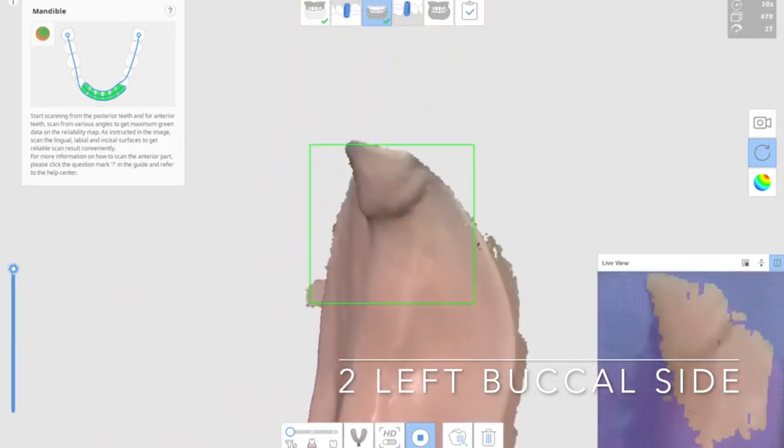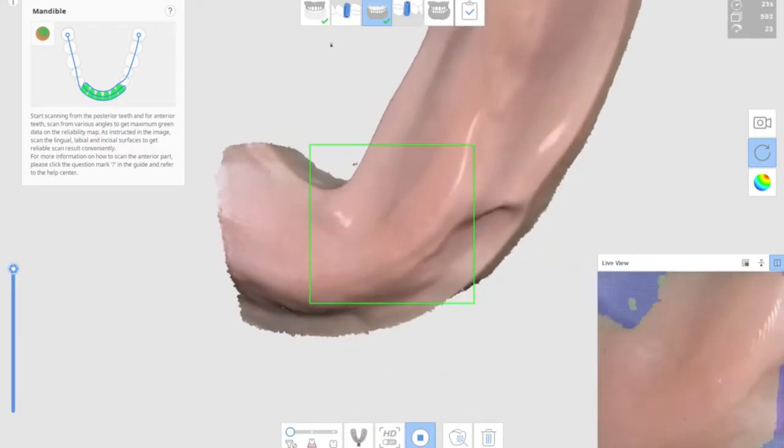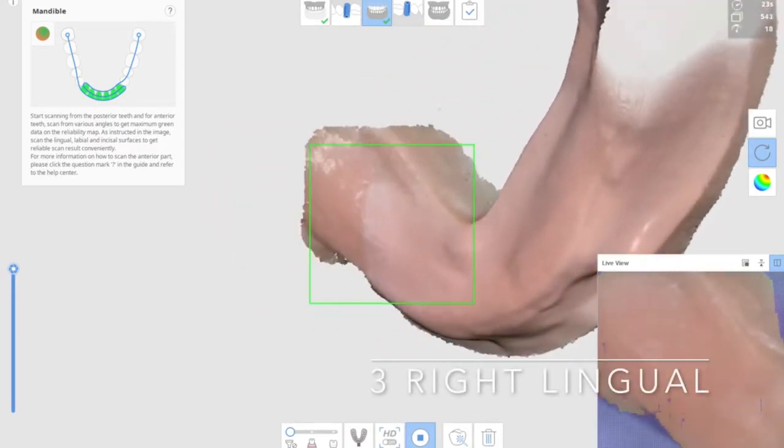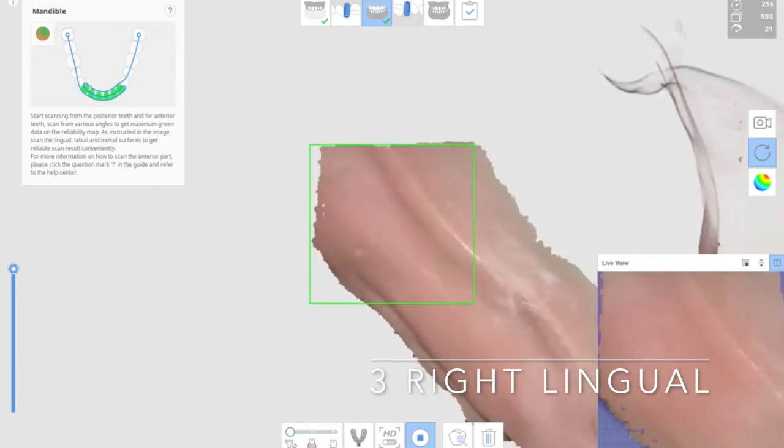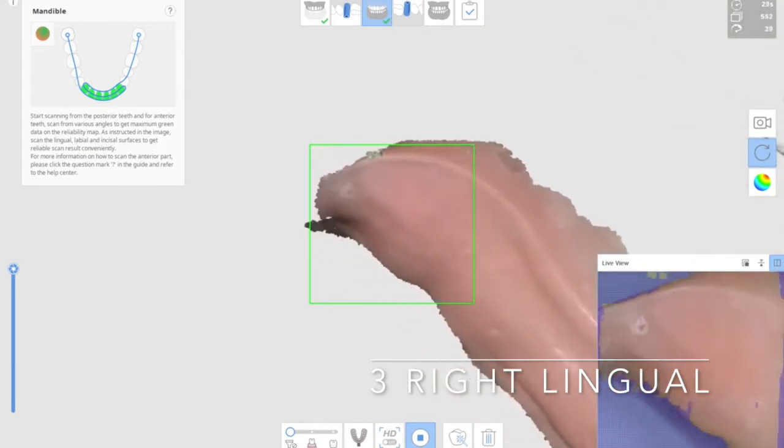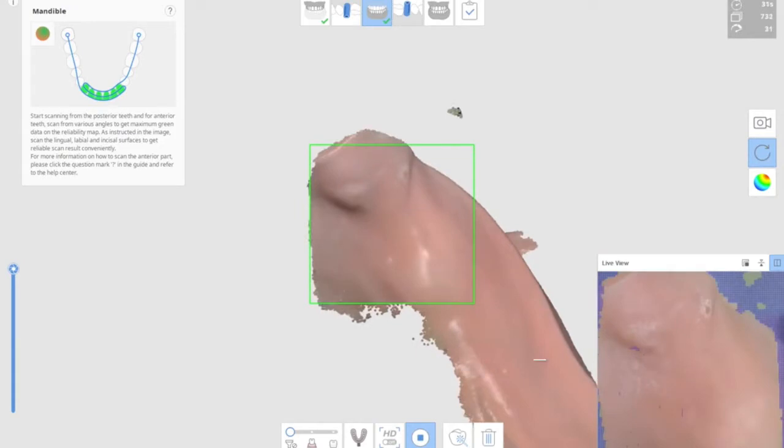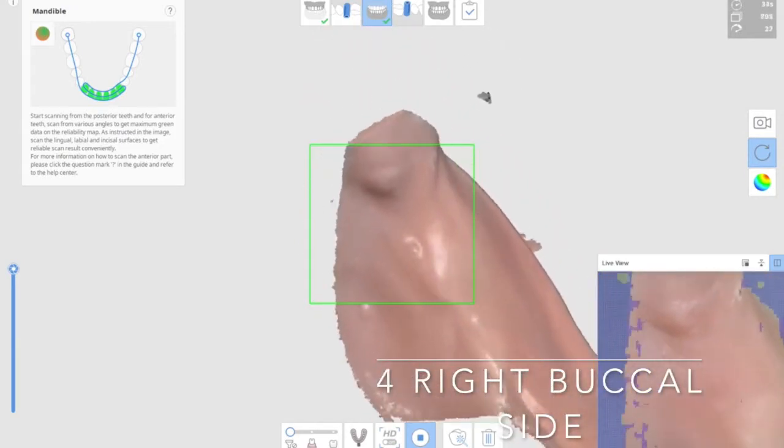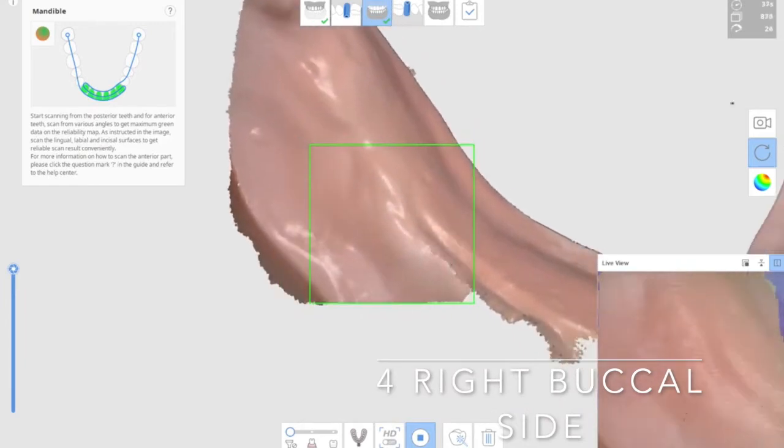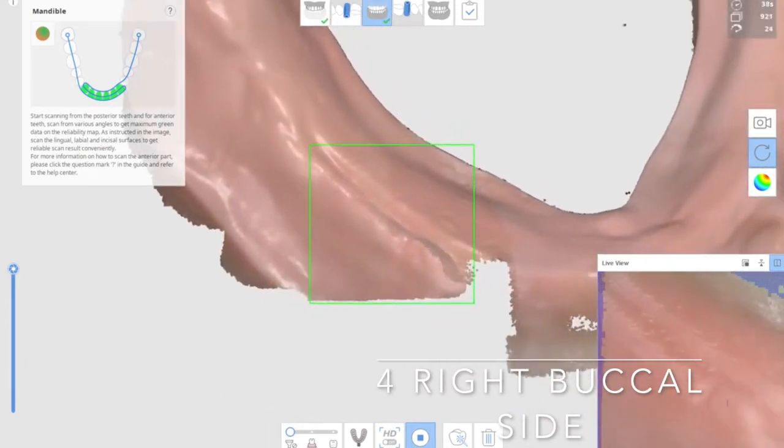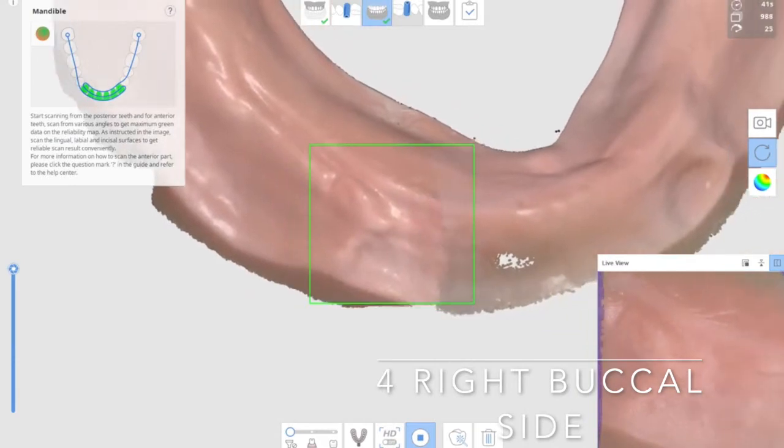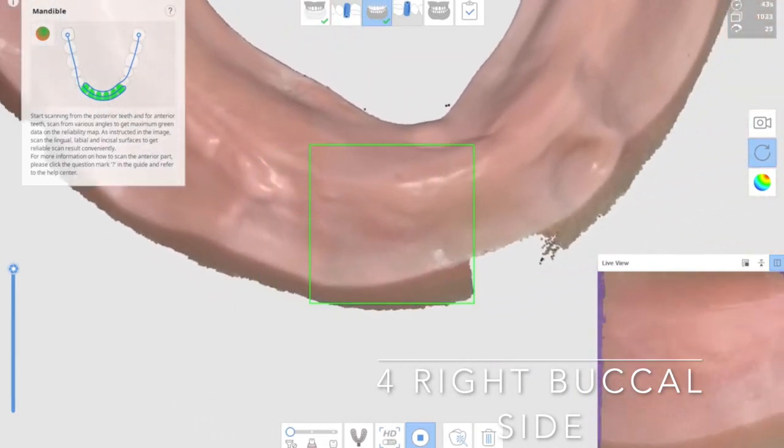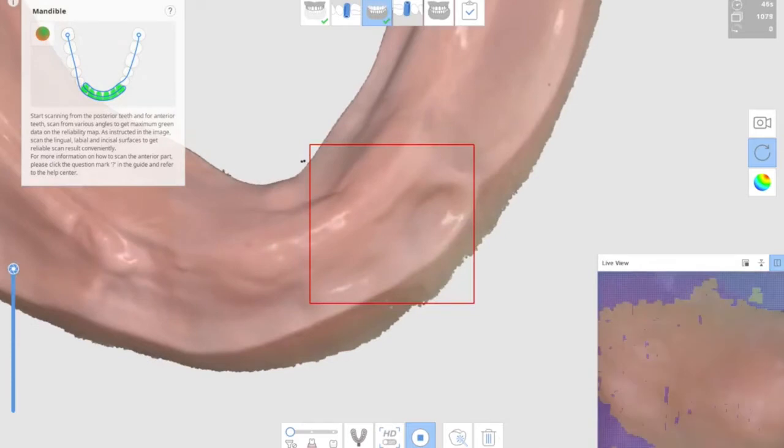Then you move on to the center and then continue on with the right side lingual surface scanning, covering the pear-shaped pad. And of course, the right side buccal vestibule will be the last part when you're scanning edentulous model. So that's how you scan edentulous model.